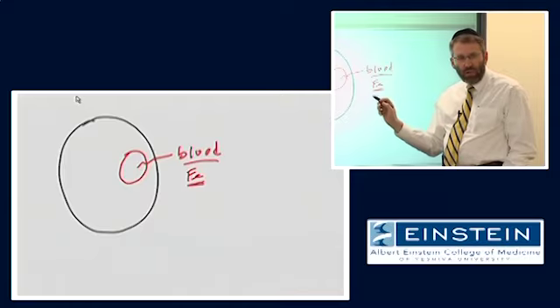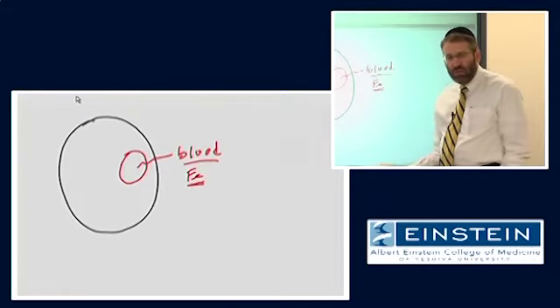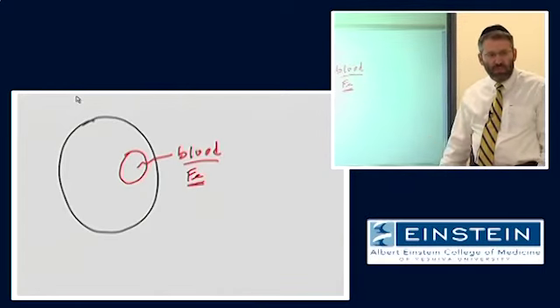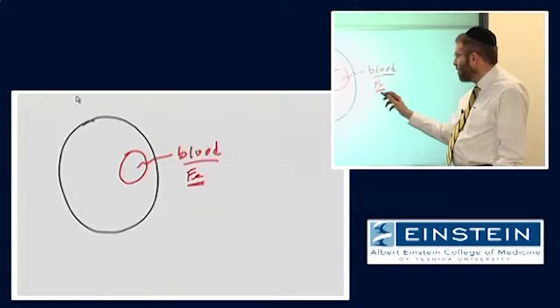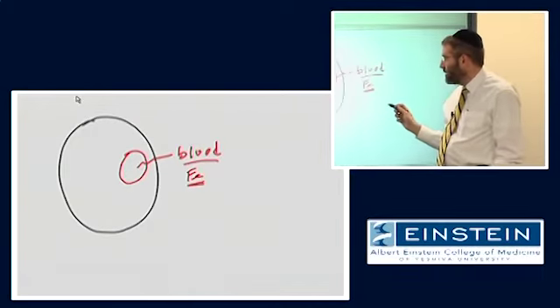When you image blood with MR, you are not imaging the blood per se. You're imaging its secondary effect on tissue. That's very different, for example, from CT, where the attenuation of the X-ray beam is a direct function of the globin protein in the hemoglobin molecule. Here we're looking at a secondary effect. So that's number one, is that we're not imaging the blood, we're imaging the tissue and the impact of the presence of that blood on the tissue.